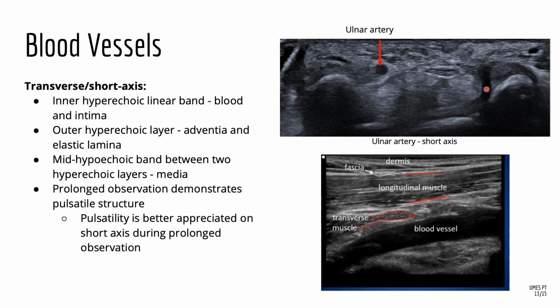So the top image depicts the ulnar artery right here in the transverse view, which can be seen pulsating when performing real-time ultrasound of the carpal tunnel. And the bottom image shows blood vessels in the longitudinal view right here.